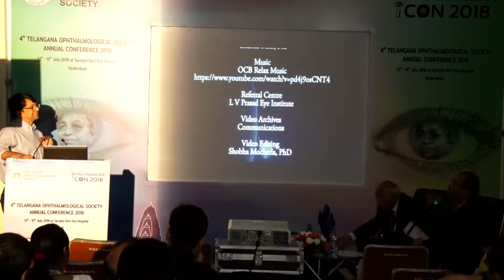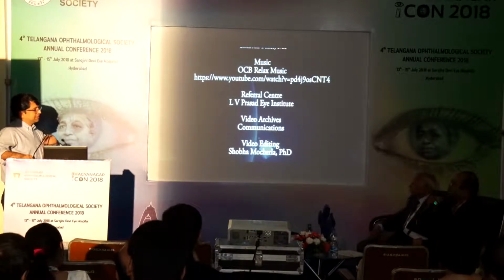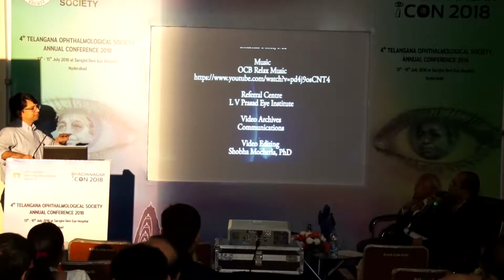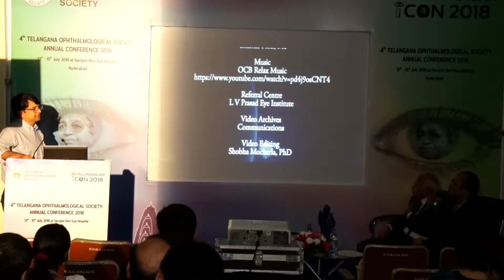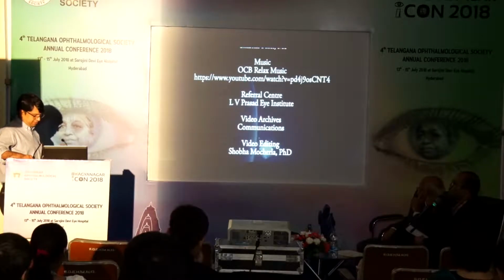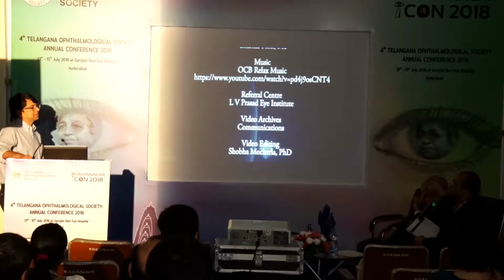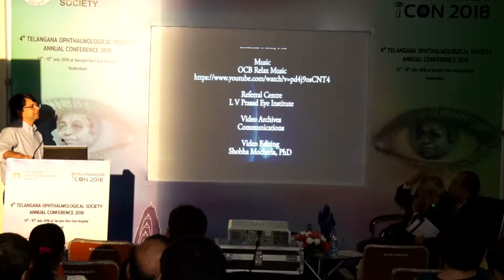So they end up having a dense degenerative pannus on the corneal surface. Once we perform a superficial keratectomy, even if your Bowman's membrane is damaged completely, it leaves behind a haze. It's analogous to PRK. When you do a PRK, we normally apply mitomycin in order to reduce the haze. Mitomycin only prevents the ongoing scarring or haze mechanism. If there is already a pre-existing scar or haze, it doesn't have any influence.